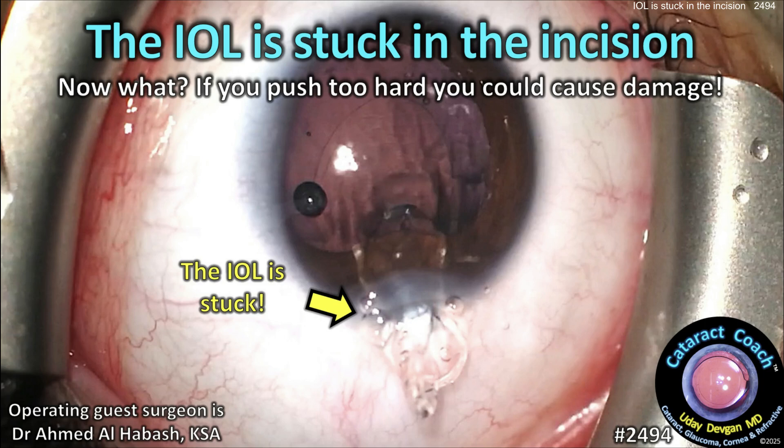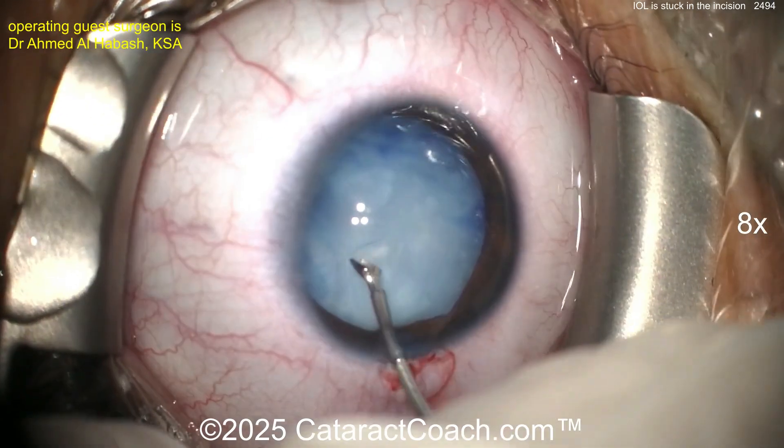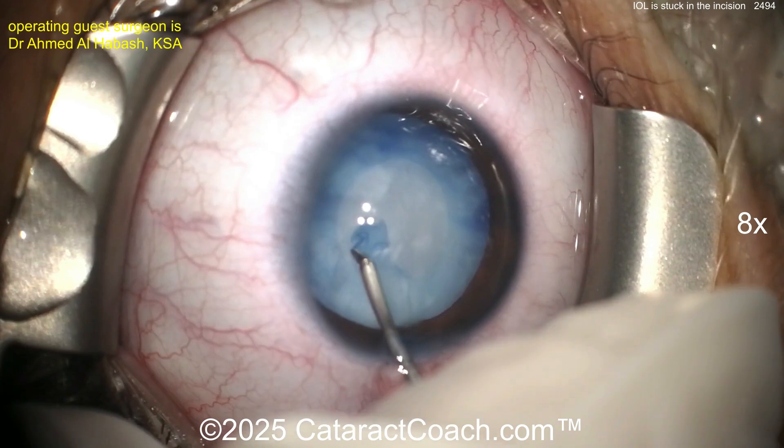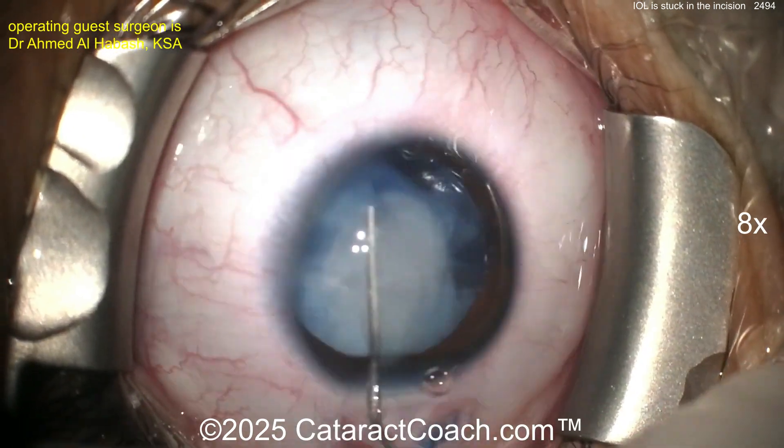cataractcoach.com — the IOL is stuck in the incision. Now what? If you push too hard you could cause damage. Let's watch: young patient here, very intumescent white cataract. The surgeon does a great job getting a rhexis done here despite having this very white and fluid-filled cataract.